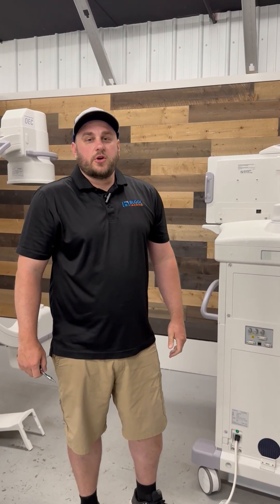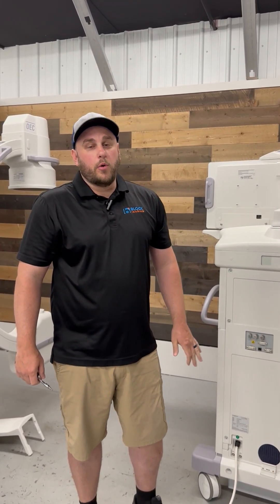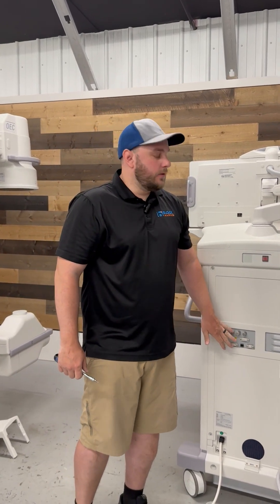Hey guys, this is Matt with Block Imaging Engineering. Today I'm going to show you how to replace coin cell batteries in both SBCs for an OEC 9900.